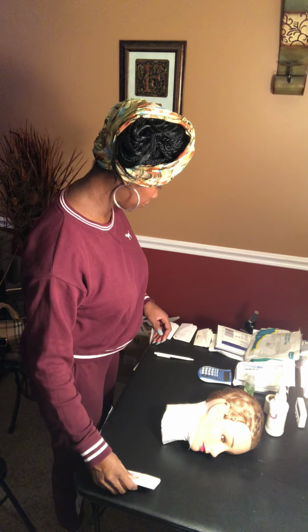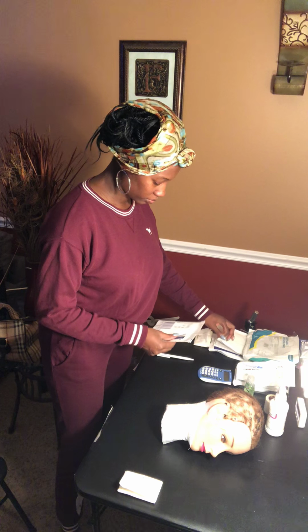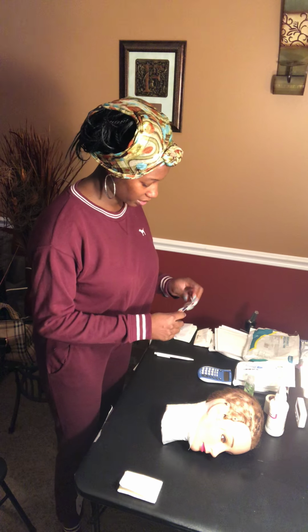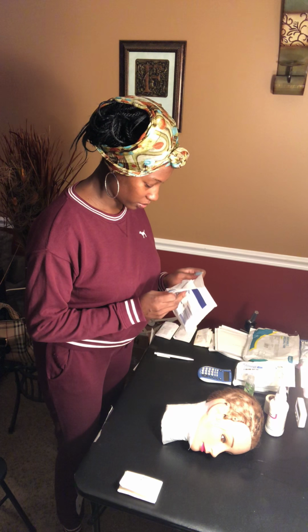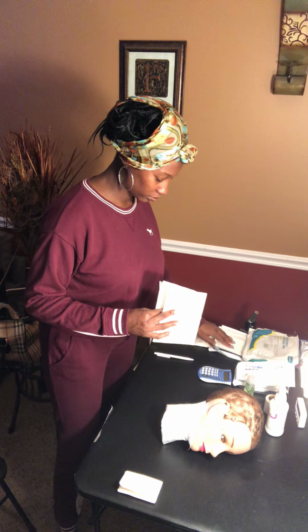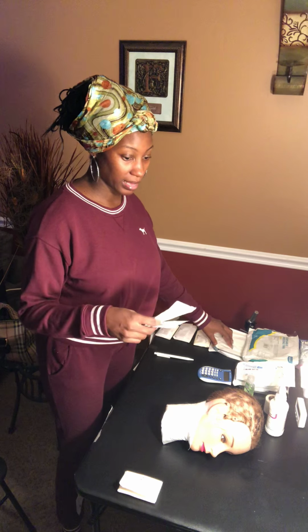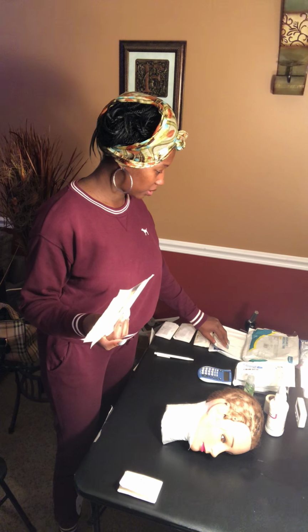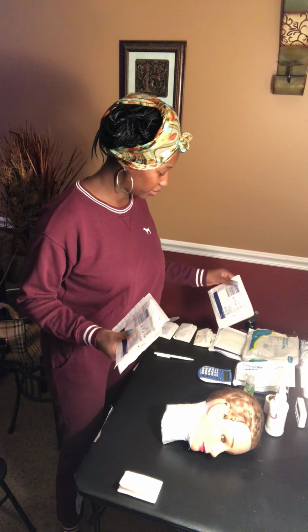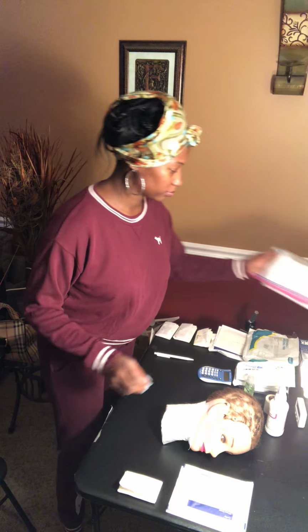Some medium gloves. I'm going to need 1. How many gauze are in here? 2 in there. So 1, 2, 3 to clean, side, middle, and 1 to put over. 1 to fluff it and put it in there, and then another 1 to put over it. My ABD.